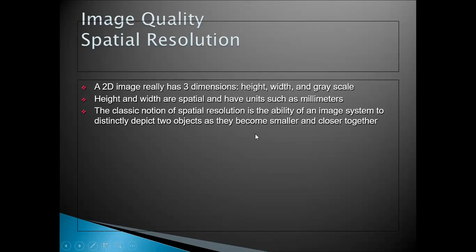We have a spatial imbalance because we have the lateral spatial resolution and the axial resolution. The top-down direction gives us the axial, whereas the horizontal direction gives us the lateral resolution. The two of them actually constitute the spatial resolution. We have encountered that earlier.